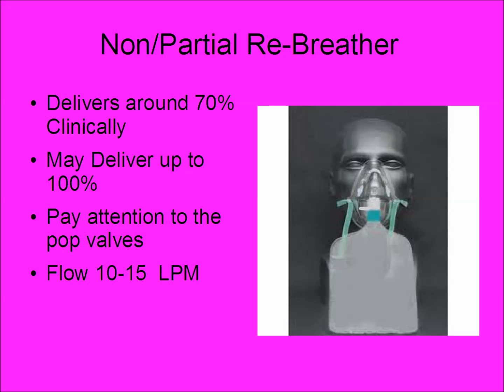A non-rebreather is going to deliver about 70% O2 clinically, but theoretically they can deliver 100%, but you're just not going to get that in the clinical setting. The liter flow you do with this is 10 to 15 liters per minute, and the goal here is to keep the bag fully inflated so that the patient, when they inhale, they'll get the O2 in the bag instead of entraining room air causing the FiO2 to decrease.